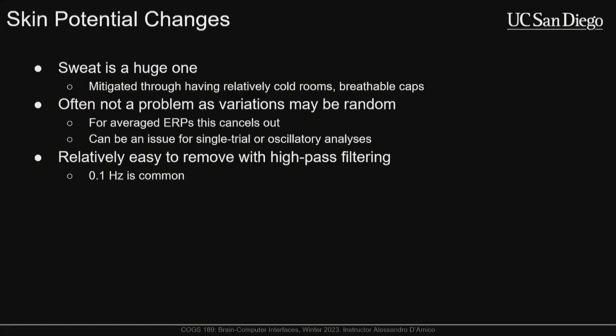I also wanted to highlight an interesting artifact, which is the tongue movement. So the tongue is also a dipole. So if you just have your mouth closed and you just move your tongue up and down, it can completely destroy the EEG data. So if you ever need a polygraph for some reason, just move your tongue a bunch and you'll get away with it.